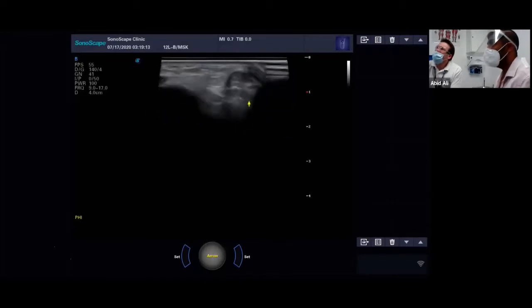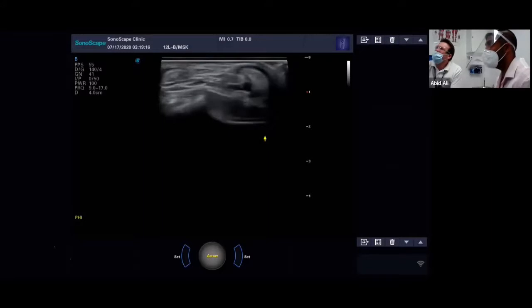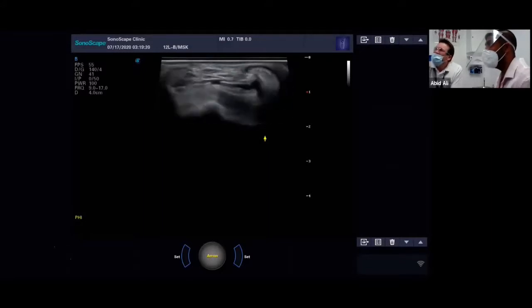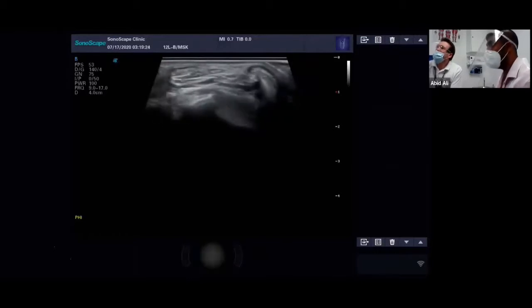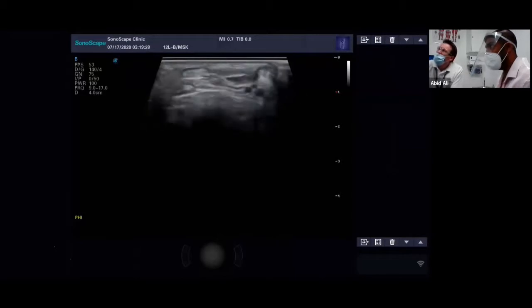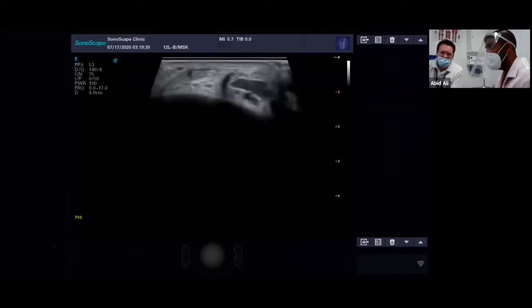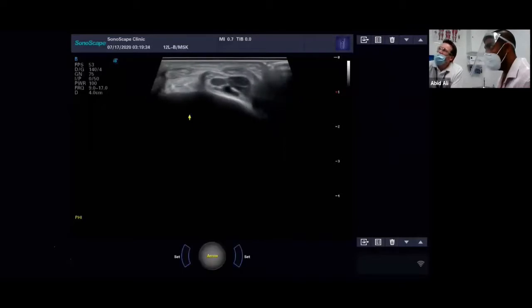Again, making sure your probe's in the right place. Let me show you a broad picture first of all. I'm right on the front of the ankle, the anterior part of it. So this is what you're going to see initially. I'm actually on the tibia here. You can see the tibia underneath, so I've not gone over the ankle mortise yet. We're just going to freeze there and point out this anatomy to you.